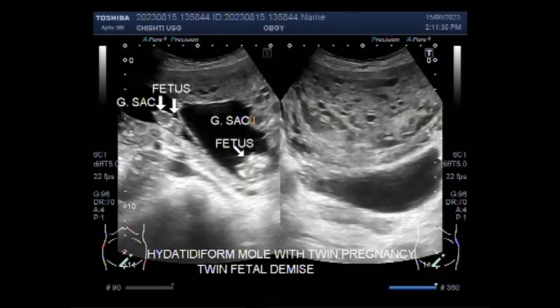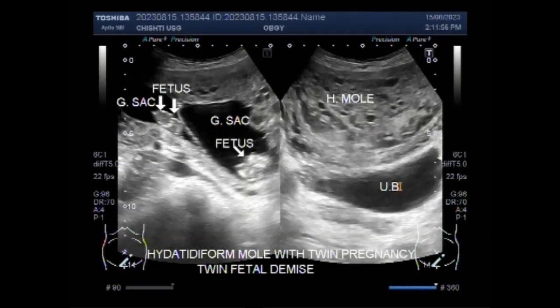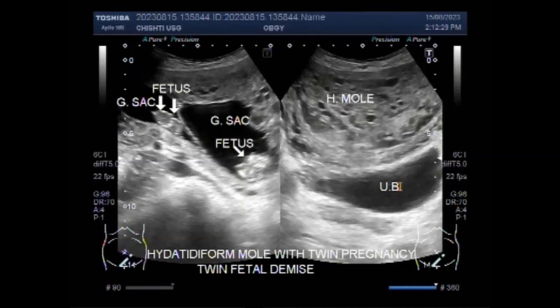A hydatidiform mole is the growth of an abnormally fertilized egg or an overgrowth of tissue from the placenta. The woman appears to be pregnant but the uterus enlarges much more rapidly than in a normal pregnancy. Most women have severe nausea and vomiting, vaginal bleeding, and very high blood pressures. On ultrasound, the hydatidiform mole looks like a bunch of vesicles with interseptal fluid seen throughout the uterine cavity. Mostly painless vaginal bleeding during the second trimester is seen. They are diagnosed by ultrasound imaging, and extremely high levels of human chorionic gonadotropin (HCG) are suggestive but not diagnostic of molar pregnancy.